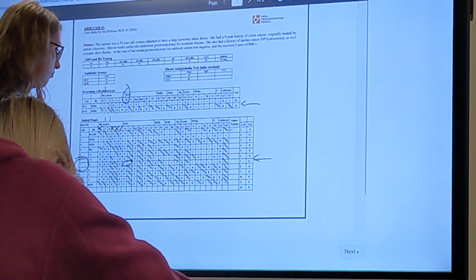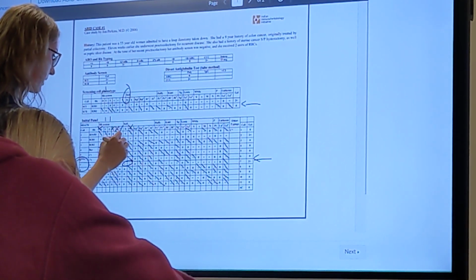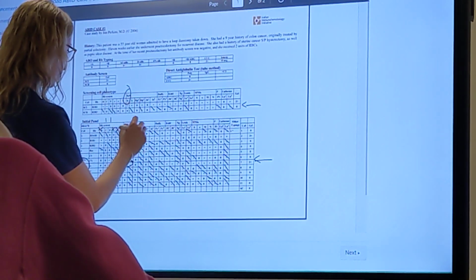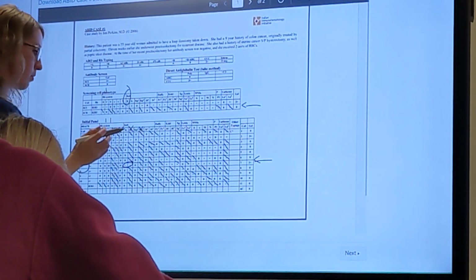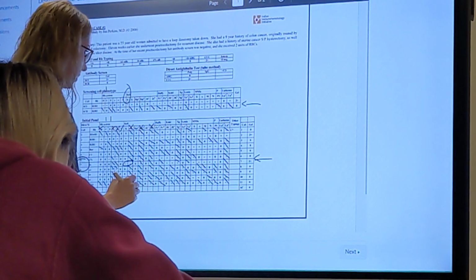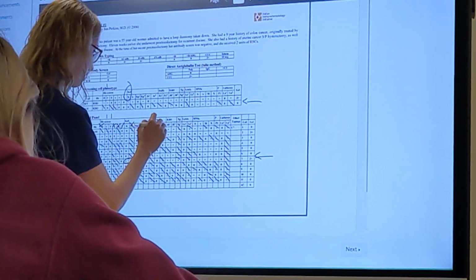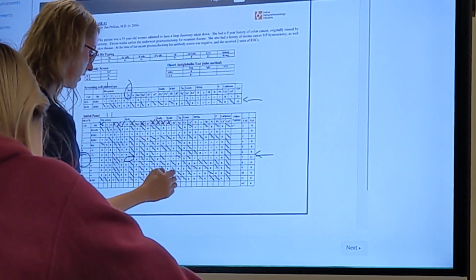I didn't mean to do that with Kell, I'm sorry. We ruled out Cellano. We're not worried about KpA, because look, the antigen's not present on any of those, even the screen. KpB, we ruled it out. JsA, there's no antigen positive cells, so we know we're not worried about that one. So JsB, we ruled it out. Duffy A, I have 1, 2, 3. Good enough for me. Duffy B, a bunch. JkA, I got 4, that's good enough. JkB, I have 3.